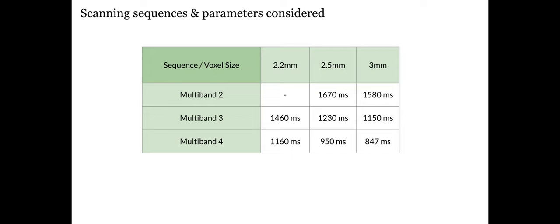So we ended up with the same number of samples because the stimulus is the same amount of time. I'm not exactly sure if that resampling will have other effects, but there will be more images per resampled step for shorter TR. I see. So I think it should probably depend on how you do the resampling too. That can maybe have an effect on your results.